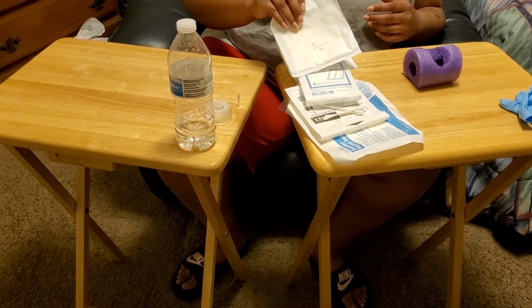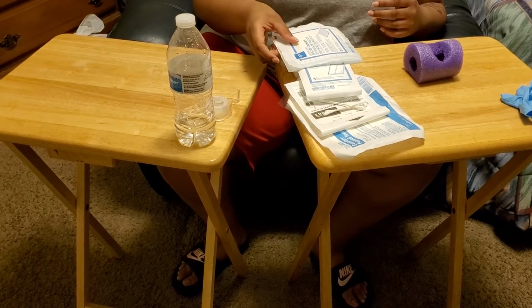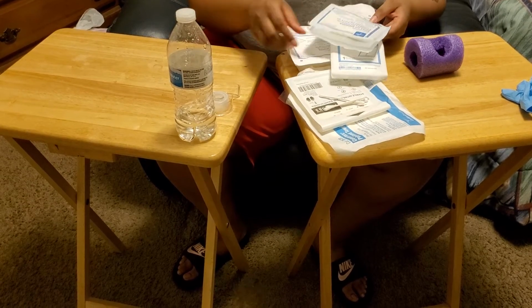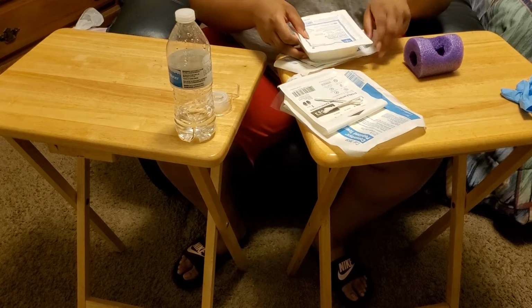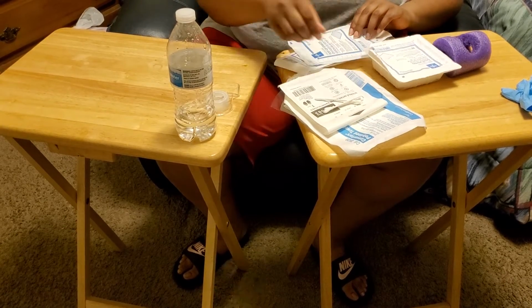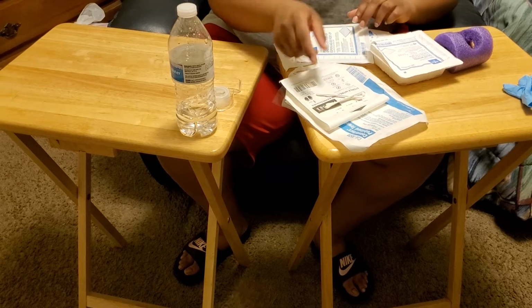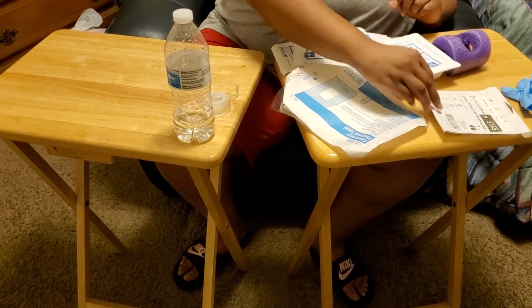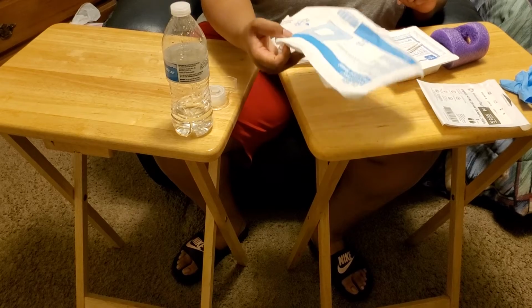All right, so my materials are the 4x4 gauzes, the ABD pad, the gauze boat, sterile Q-tips, even though they're not in the packaging, just improvising, they would be sterile inside of a pack. Alrighty, sterile gloves, as well as a polyline towel.